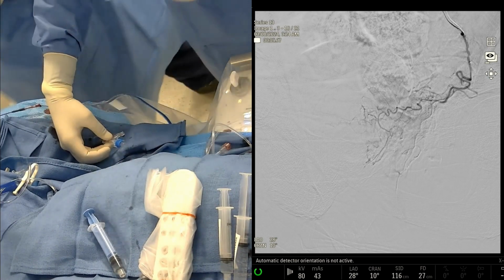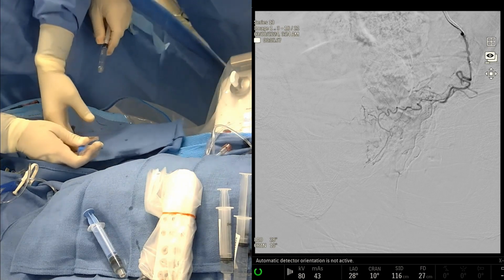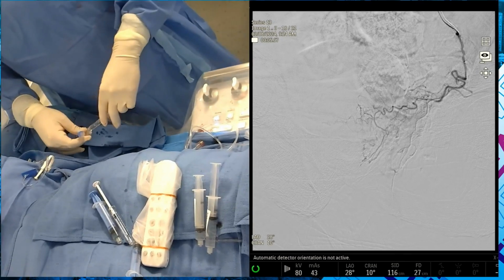Okay. I think you're seeing nice periurethral supply too, and even some cross filling to the other side. Yes. Maybe we can backtrack a little bit. So here's our next angio.